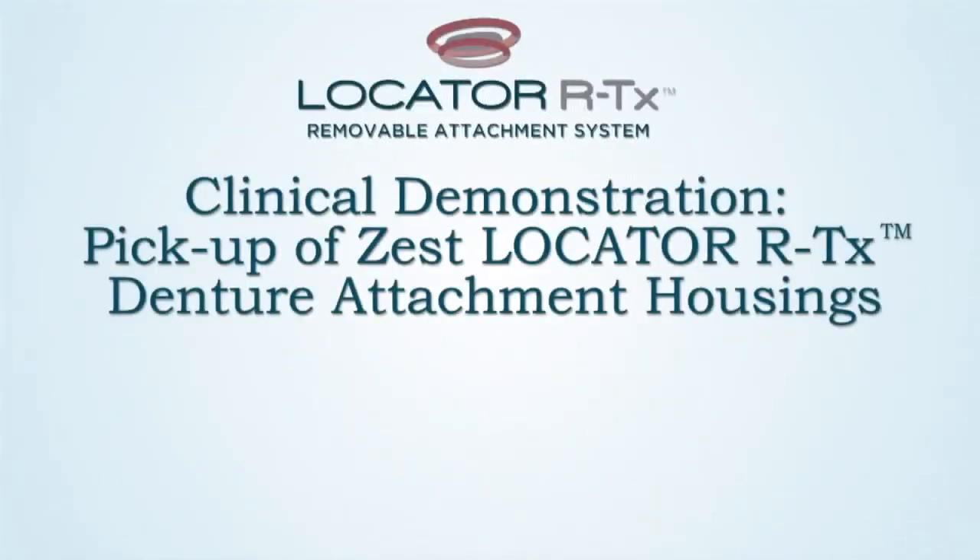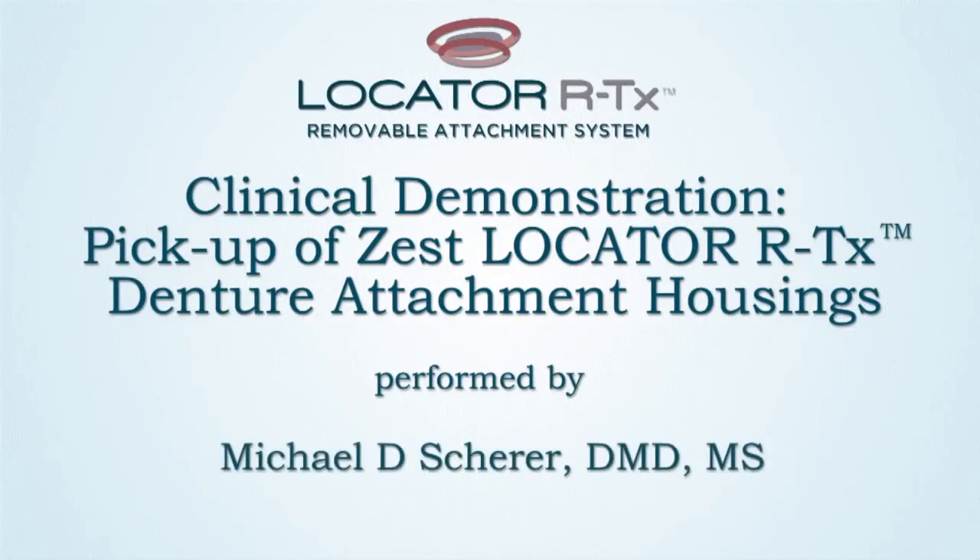This has been a clinical technique demonstration of the pickup and attachment processing procedures for Locator RTX. Thank you for tuning in. This is Dr. Michael Scheer with LearnLocator.